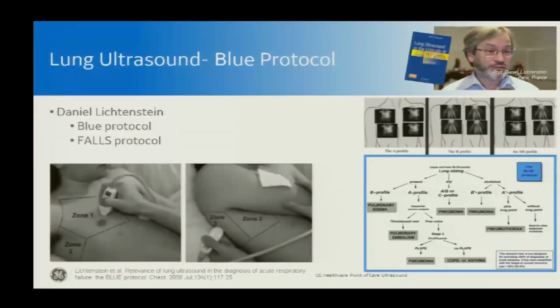Now, I've referred several times to Professor Lichtenstein because he is one of the most knowledgeable physicians there is on lung ultrasound, and he was one of the pioneers, if not the pioneer, of lung ultrasound. So you should know who he is and his impact on looking at the lung with ultrasound. He's written many papers, but he wrote 2 in particular that you will hear about quite frequently. And the most important and most referred to paper is on the Blue protocol. So you've probably heard about that.